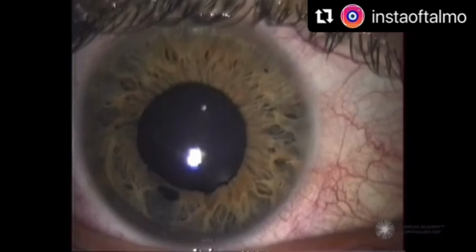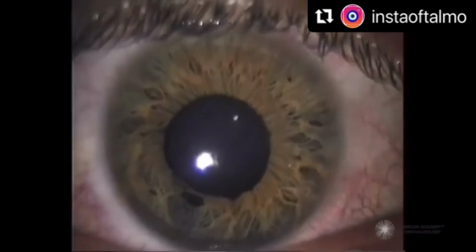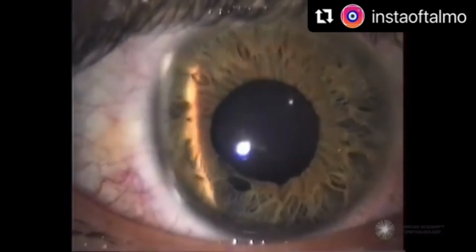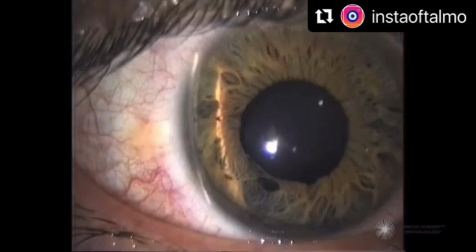This is a patient with angle recession glaucoma. Note the sphincter tear inferiorly. If we put a thin beam of light on this patient's cornea and direct it at the very far temporal portion of the cornea, we can see that the anterior chamber is very deep. Here at higher power, we see the corneal thickness and the very, very deep anterior chamber thickness.